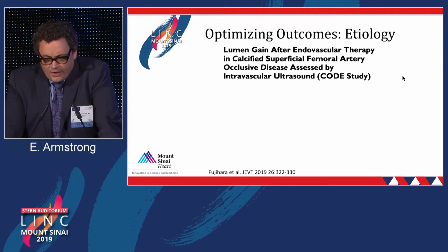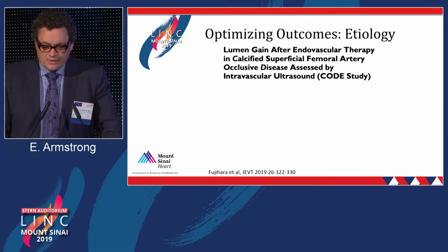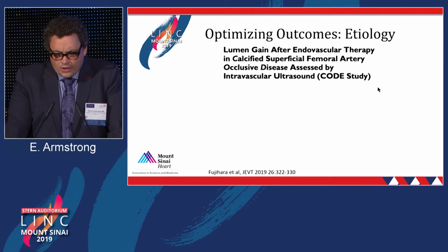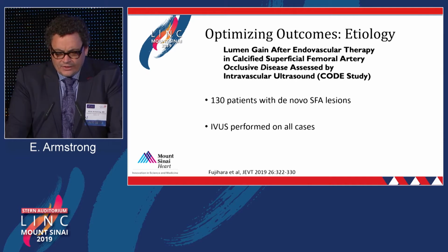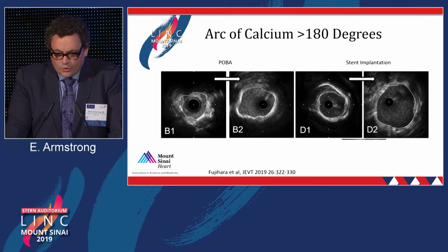Finally, with regards to etiology, I think we all recognize that calcium is a major limitation with regards to outcomes of current endovascular therapies. A recent publication by Fujihara et al. in the Journal of Endovascular Therapy, entitled The CODE Study, I think provides a lot of new additional data with regards to optimal treatment of calcified lesions. This study involved 130 patients with de novo SFA lesions. IVUS was performed in all cases, and lesion calcification was assessed by IVUS as well as using the PAC score.